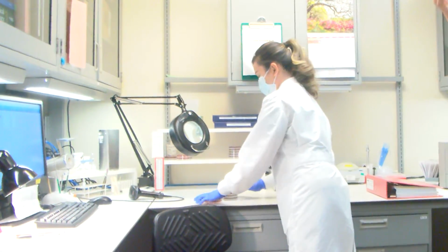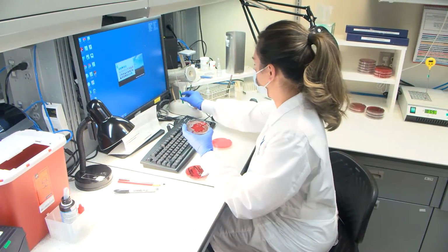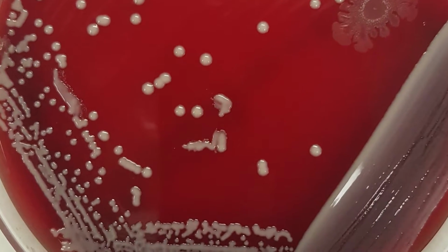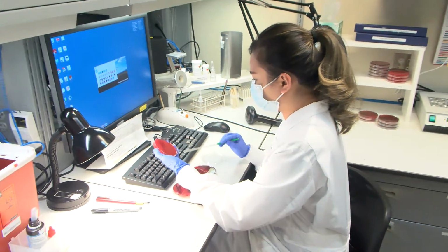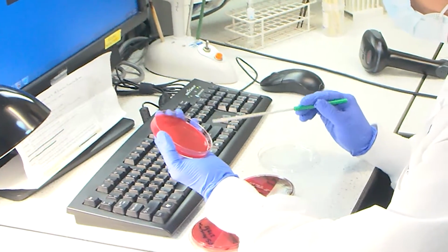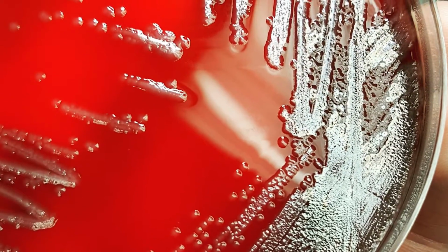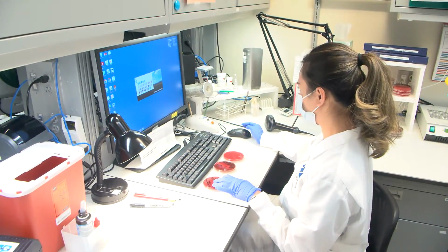Daryl is one of our microbiologists. She has special training in looking at bacteria growth on these agar plates. Some people might know these as petri dishes. And one cell of bacteria can actually grow an entire colony on this plate. The agar contains nutrients that the bacteria like and help us take anything like a tissue sample, a joint fluid sample, a throat swab, any patient specimen. We can see what bacteria are present.